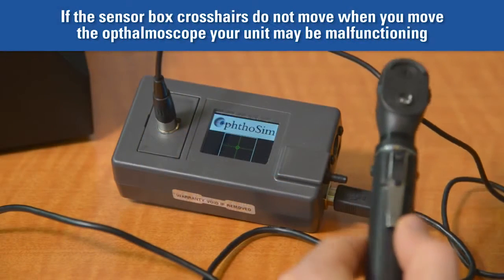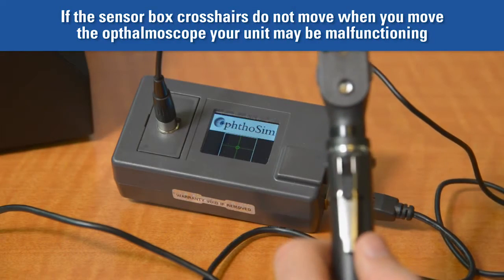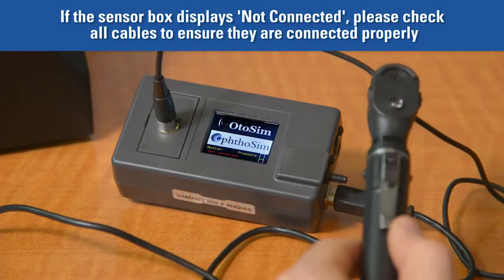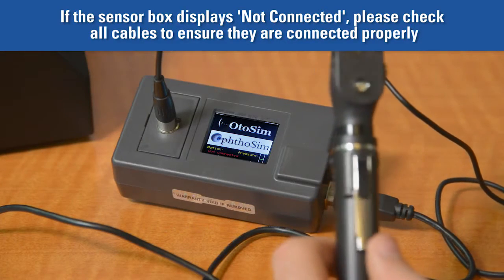If you do not see any motion in the green crosshairs when you move the ophthalmoscope, your unit may be malfunctioning. If your unit displays 'not connected,' you should check that the cable connections between the sensor box and ophthalmoscope are tight.